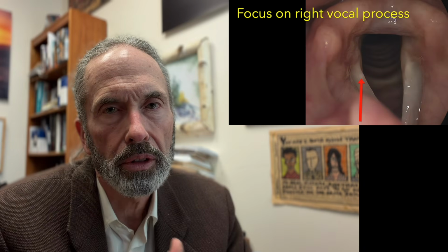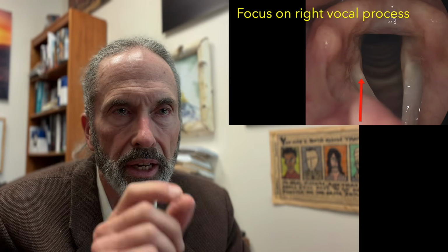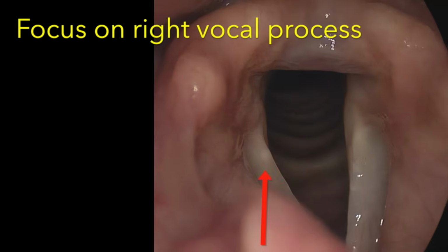So now we're going to turn our attention to the other side, the right vocal process, and we're going to watch that little white spot, what it's doing.